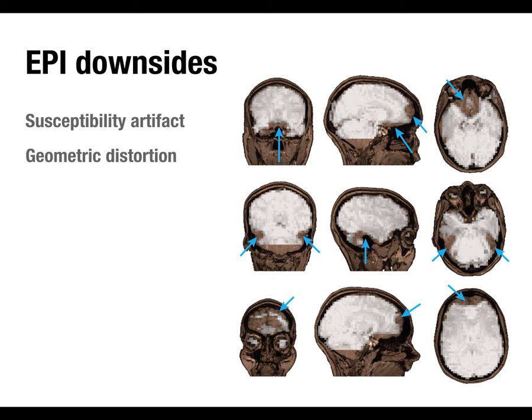Well, in that case, and in any case of brain resection, wherever the brain is missing, there's CSF. So it's a liquid-brain interface, which is much less of an issue than an air-brain interface. The issue would be more if, for whatever reason, somebody had extra air pockets outside the skull cavity that the CSF is contained in, but near there. Sometimes you get distortions around, like if somebody's had neurosurgery, you can tell because there are differences there.